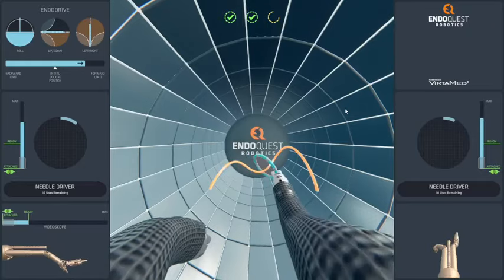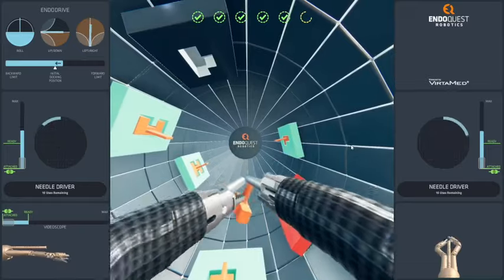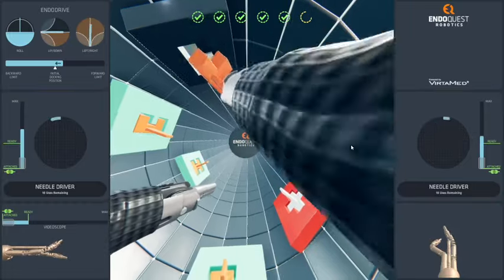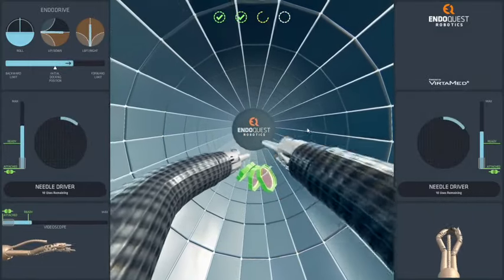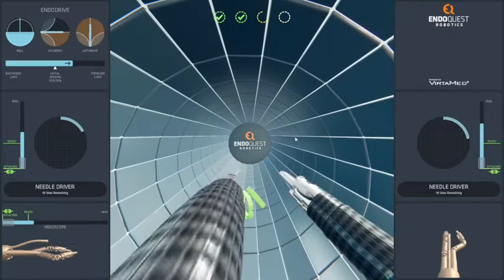The ring roller module focuses on using instrument articulation, and the shape transposition module focuses on using two-hand coordination. There are also intermediate skill development modules, including needle handling and suturing with the right and left hand from various angles.